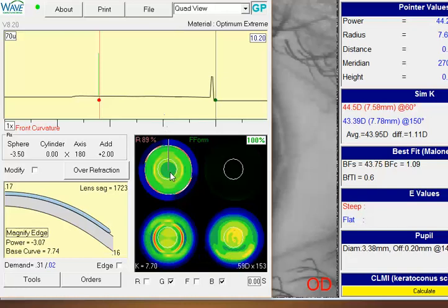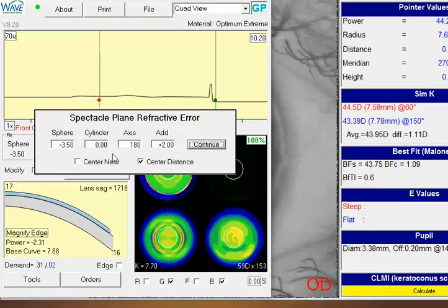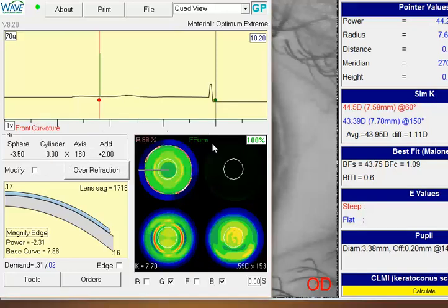But a couple thoughts. From your clinical request, it looks like you are getting kind of a paradoxical result where when your pupil is larger, the vision is better, and the pupil is smaller, which you would expect it to be improved looking through the center of this lens. Oh, and by the way, I looked at your lens design. It looks like you are a center distance lens.